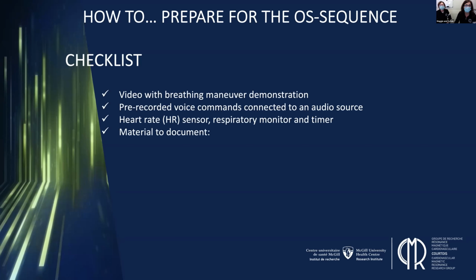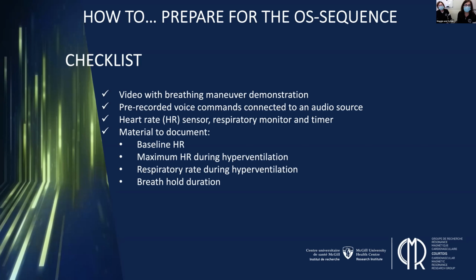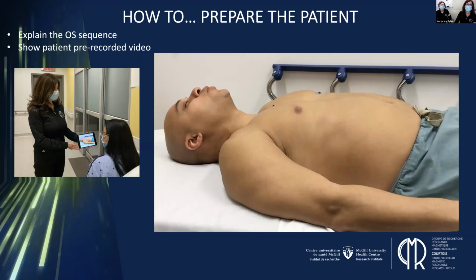And these points are the baseline heart rate, the maximum heart rate during hyperventilation, the respiratory rate during hyperventilation, and the maximum breath hold of the patient or participant. This data will be used later during image analysis.